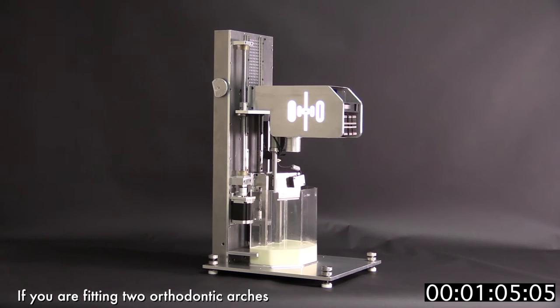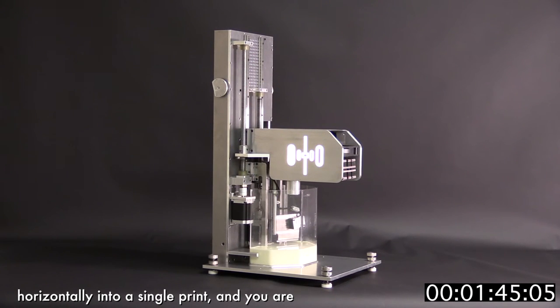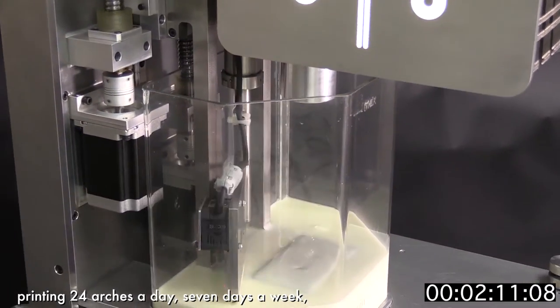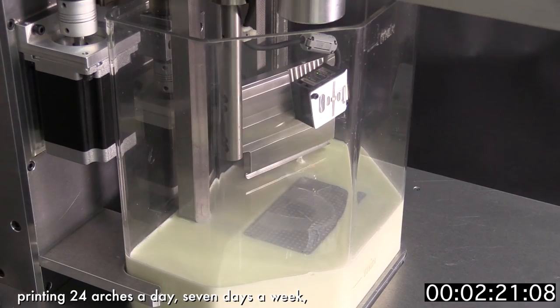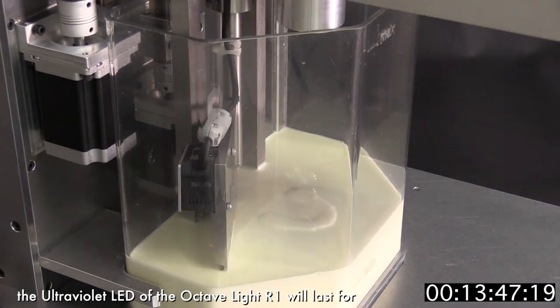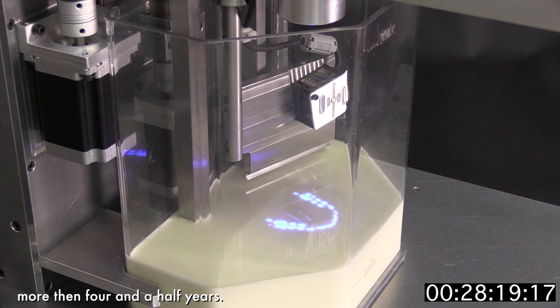If you are fitting two orthodontic arches horizontally into a single print and you are printing 24 arches a day, seven days a week, the ultraviolet LED of the Octav Light R1 will last for more than four and a half years.